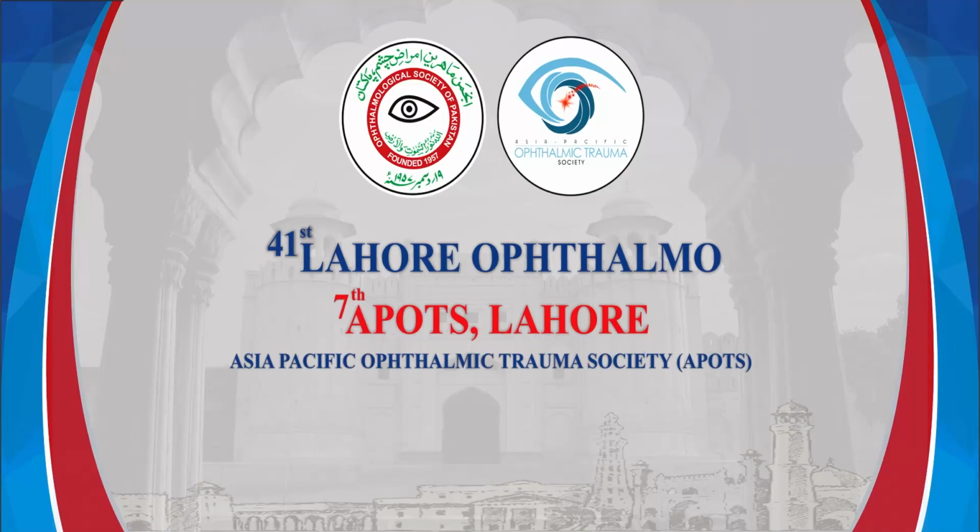Congratulations, everybody. Fantastic talks. My question is for Dr. Slawomir. My limited experience with amniotic membrane grafts is very similar to Professor Hussein's. I use a small graft under air, and it usually sticks in place, in a couple of cases. But in your technique, you put in a large amniotic graft under PFCL. First question is, do you worry that it might trap some PFCL in the hole? Second question is, later on you showed the hole closed nicely, and the amniotic membrane graft started to peel off temporarily. Would you consider removing the graft later on, since the retinal tissue has healed underneath it?